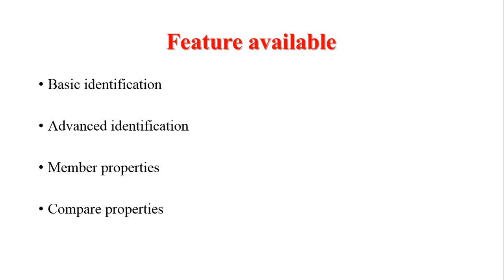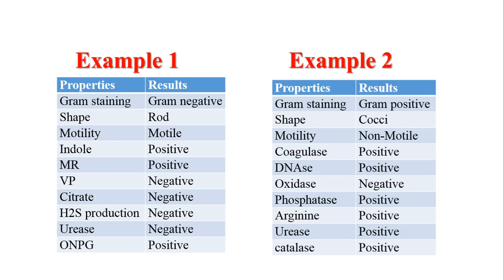The features available include: basic identification, where you fill in biochemical and microscopic examination information and get a list of possible organisms; and advanced identification, where you can fill in more results with a higher number of biochemical and microscopic test options. There is also a member property option where you can search for properties of a known bacterium, such as E. coli. Finally, you can compare the properties of two members, for example comparing Salmonella and Shigella.